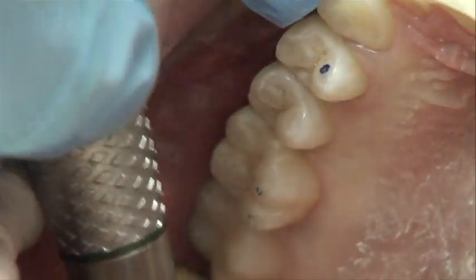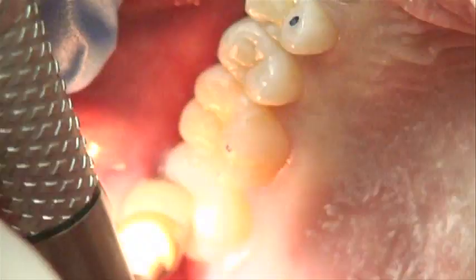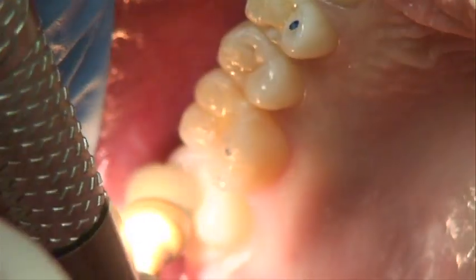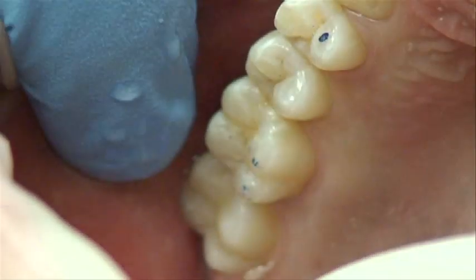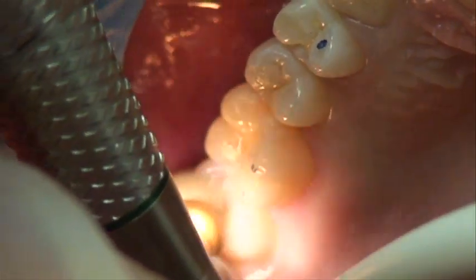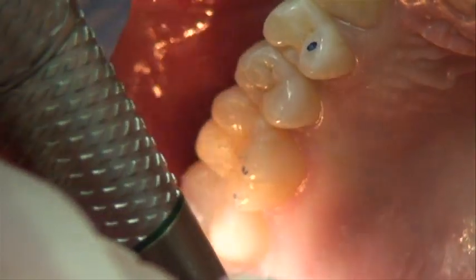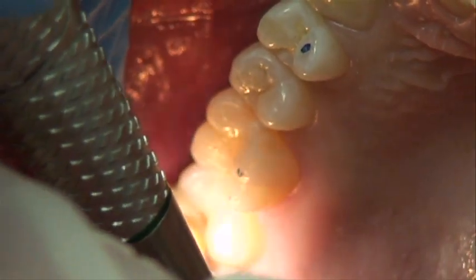And our library at the LA Institute has a few videos that explain the details of that bite adjustment. That is so important. I have to emphasize. You want to adjust the bite really, really well with a two-color technique. And then the very last thing is to polish it. When you polish it, you're going to get nice finishes.